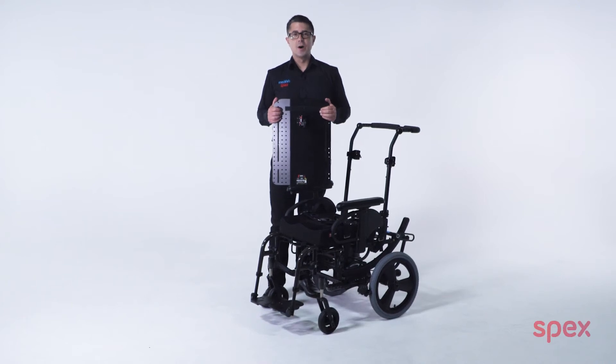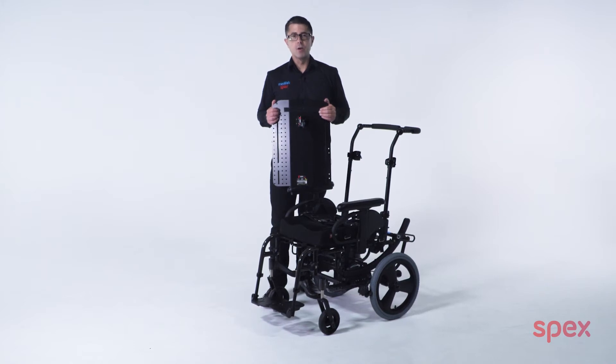Hello, in this video I will be showing you how to achieve installing a wider back support onto a narrower wheelchair.